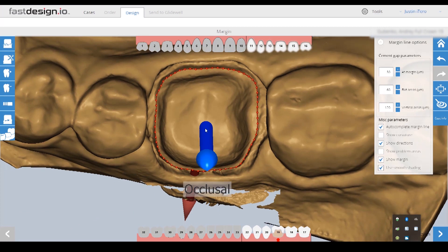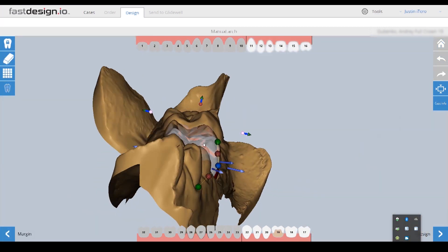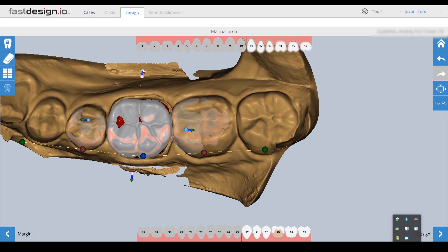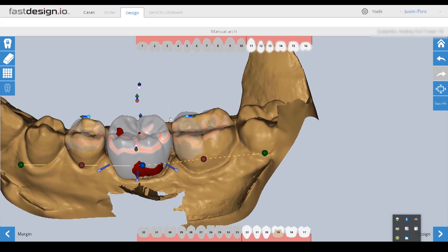After the margin is placed, I then establish the occlusal and buccal orientation so the software will know how to best position the library tooth for this prep. Once Fast Design establishes the correct tooth orientation, we can customize the initial design proposal's angulation, position, and size.